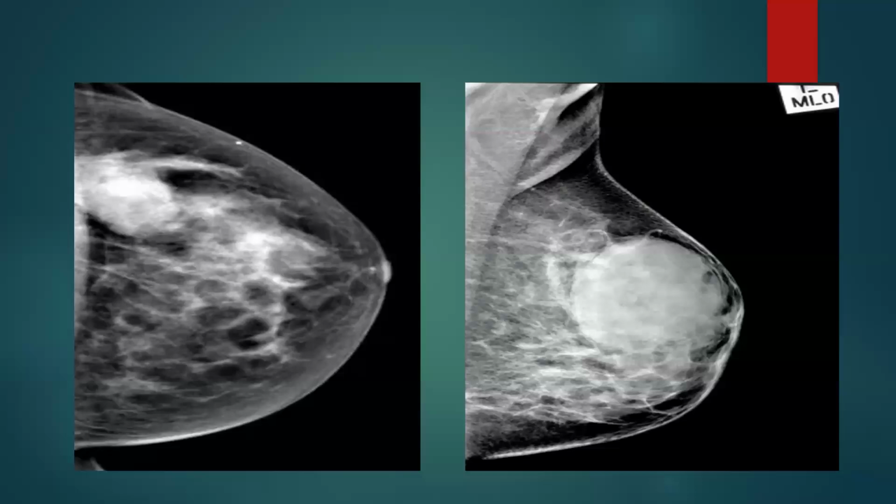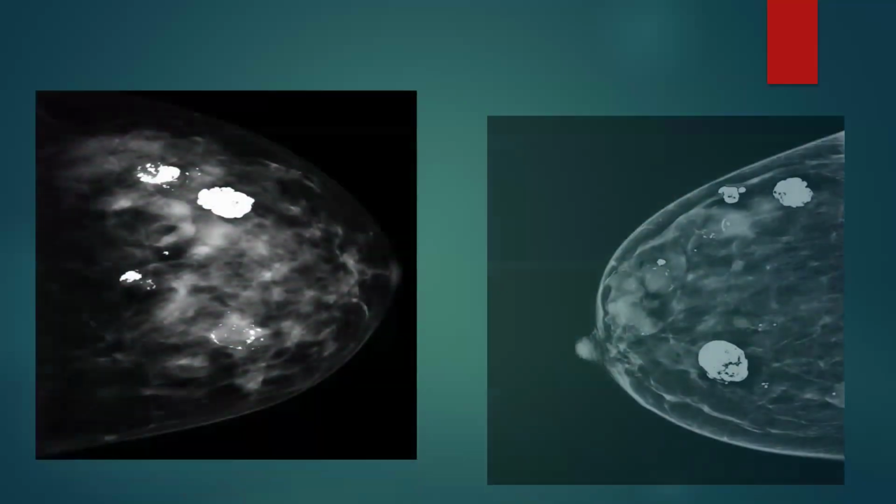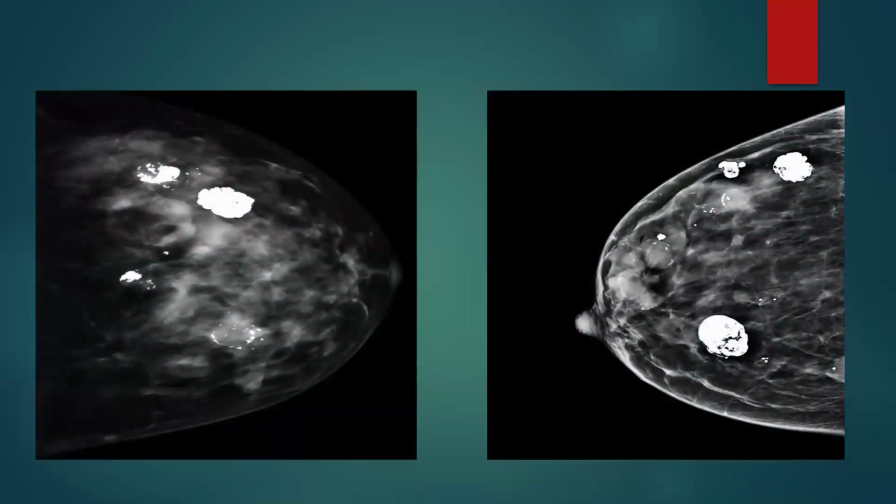An image of a fibroadenoma, a well-defined, hyperdense breast mass in both images. This is an image of bilateral breasts showing involuted fibroadenomas. There is patchy and dense asymmetric fibroglandular tissue in both breasts.